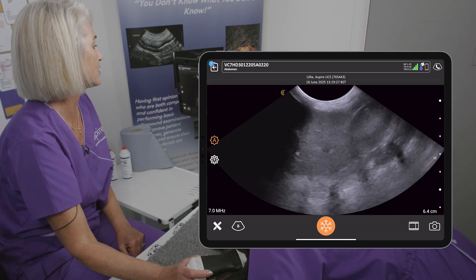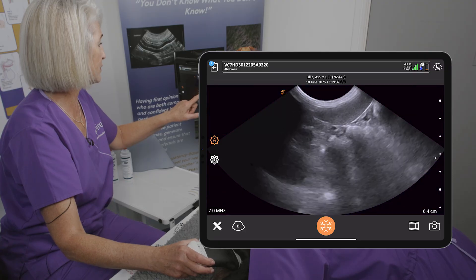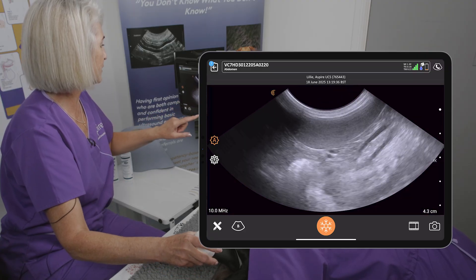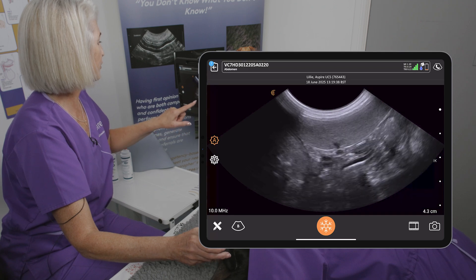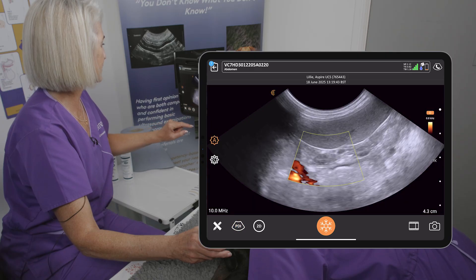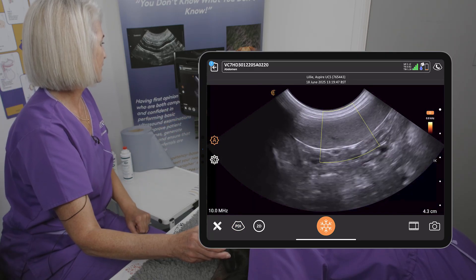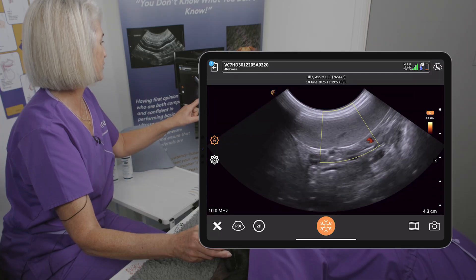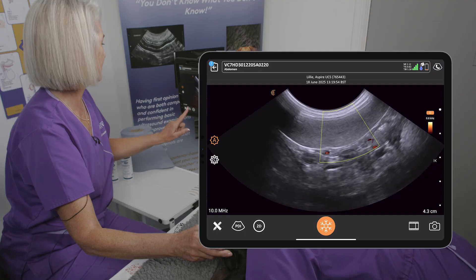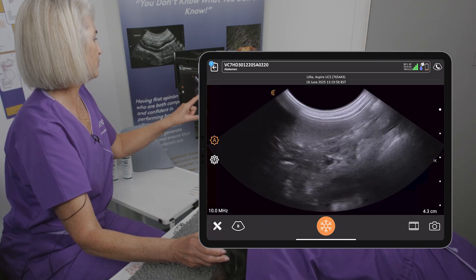This rib shadow pattern is great proof that I've actually seen the head of the spleen, so I've taken an image there. Then scanning through to look at the body of the spleen, staying in the long axis section. If you're worried about vascularity, there's nothing to stop you adding a little bit of power Doppler — here we go, we can see flow in there, which proves that there is vascularity within the spleen.